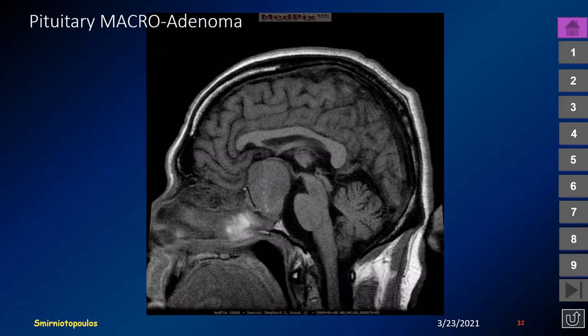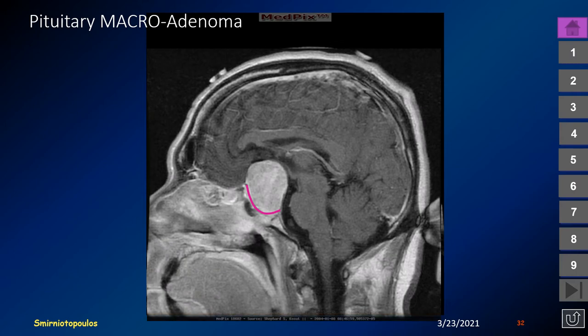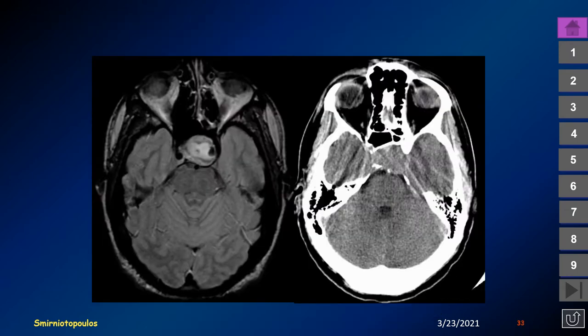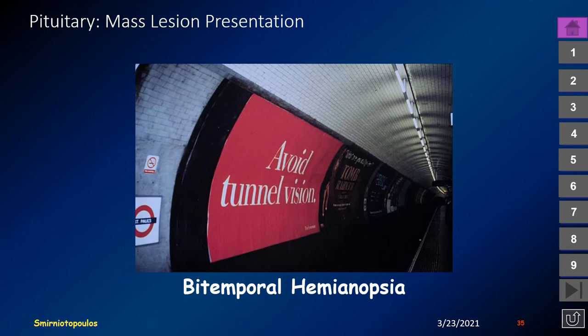This is a pituitary macroadenoma. It has grown out of the ballooned pituitary fossa and into the suprasellar cistern. The neural tissue — the hypothalamus — is draped over the top of the mass. The mass shows homogeneous enhancement, but many macroadenomas undergo degenerative changes including hemorrhage and necrosis and will enhance heterogeneously. In this different patient with a macroadenoma, the lesion is heterogeneous but we can still see signs of bone remodeling around the pituitary macroadenoma.